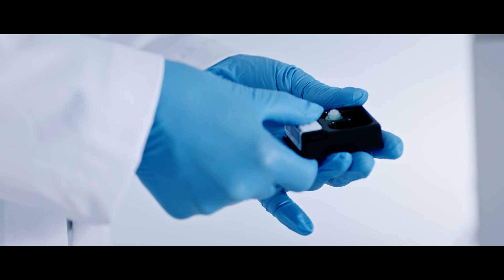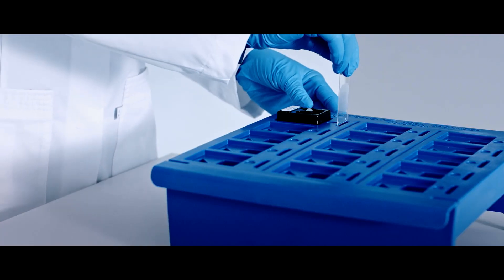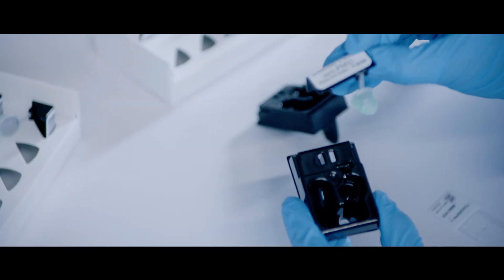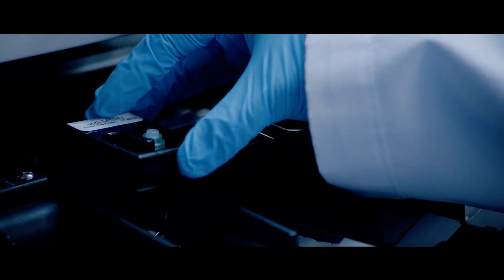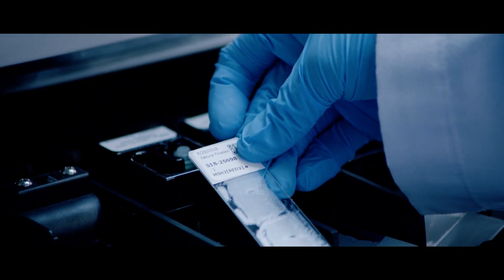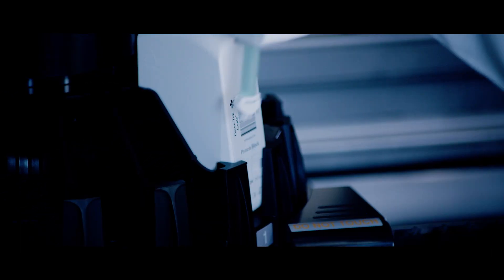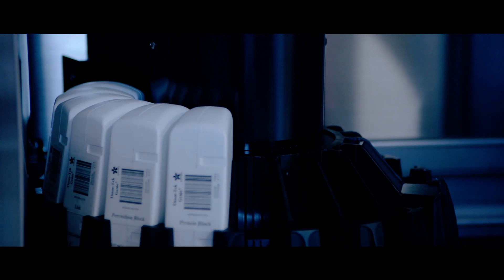Forget time-consuming slide sorting or grouping. Just load your next high priority slide or case and start staining. Use Genie's innovative single-use capsules for antibodies or probes and load them on Genie together with the slides. No need to worry if you have all the required antibodies on board. Leverage the 250-test cartridges for detection systems and antibodies for high volume demand.